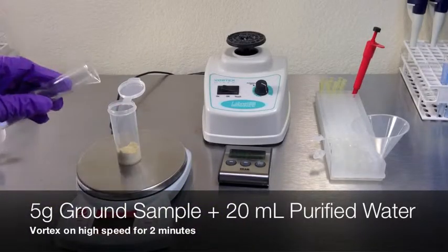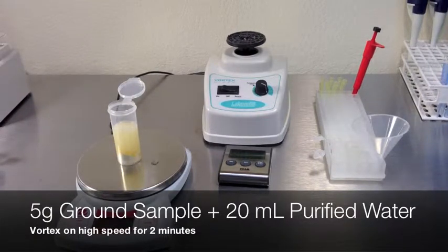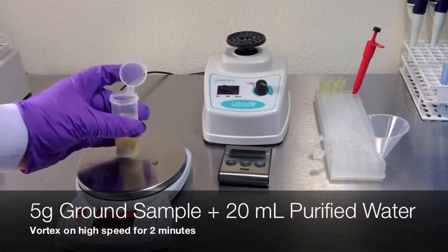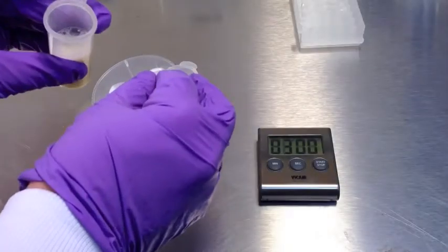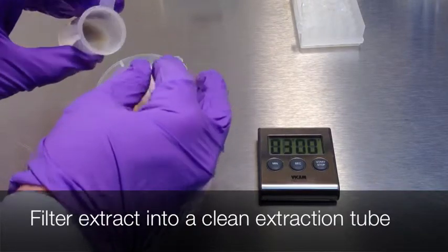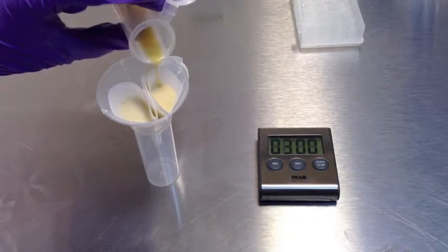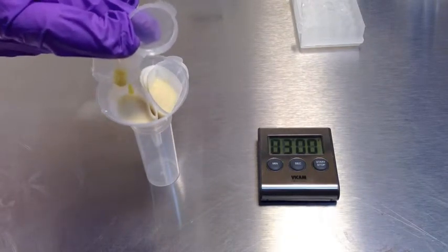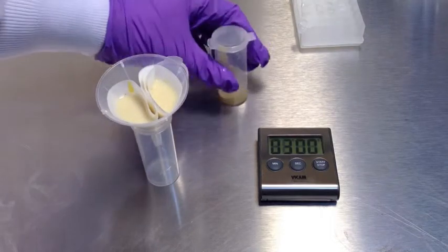Add 5 grams of ground sample and 20 milliliters of purified water to a disposable extraction tube. Close the lid and vortex on high for 2 minutes. With a disposable paper filter and reusable funnel, filter the extract into a new disposable extraction tube. Allow the sample to filter for 3 minutes.